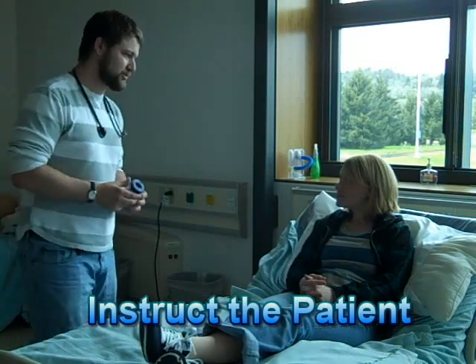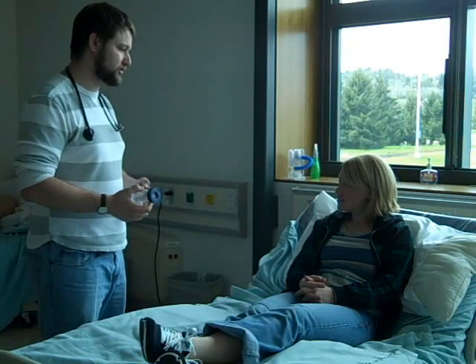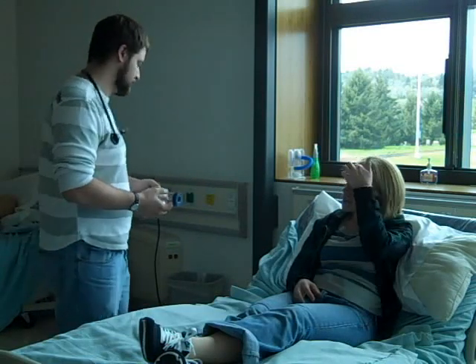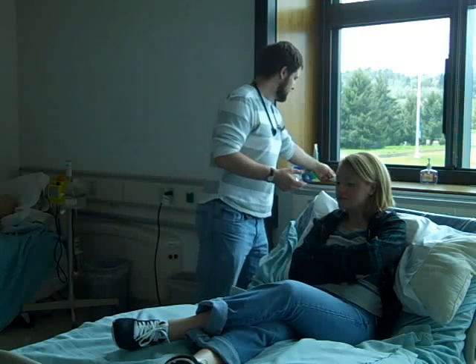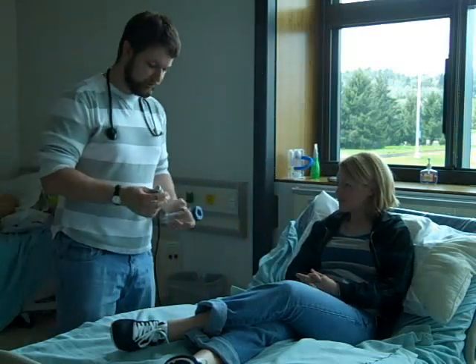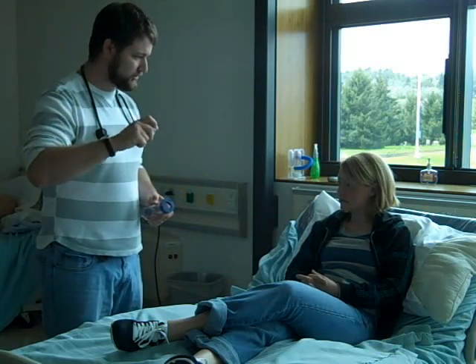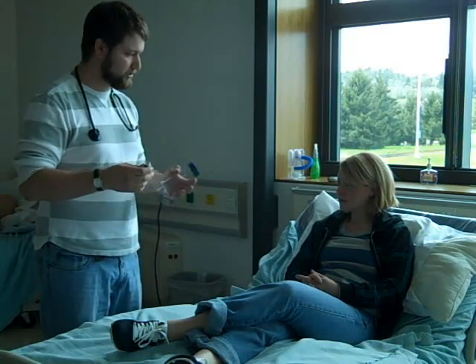Hello, my name is Jason from the respiratory department. Today we've got a couple inhalers here to help better control your asthma when you're not at the hospital. I'm going to start out with this one — it's an MDI, or a metered dose inhaler. Basically, every time you depress this, it'll give you a certain amount of medication.